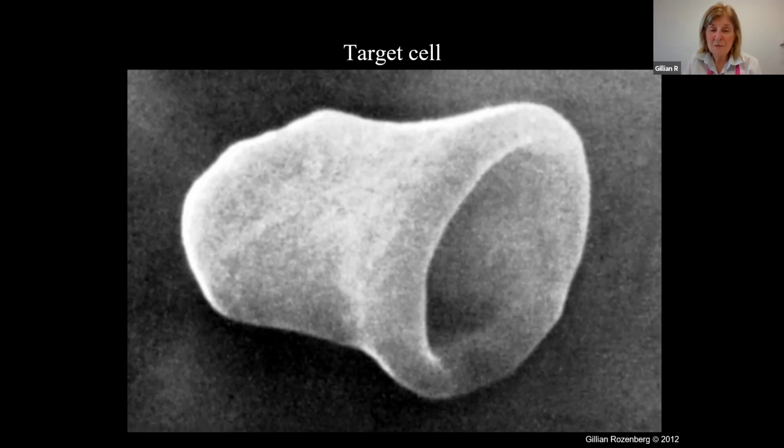It's really, really important to remember one thing that you may not find in many textbooks, and that is that the surface area compared to volume is increased in target cells. So that means if you've got moderate numbers of target cells on a blood film, that will actually reduce your mean cell volume.